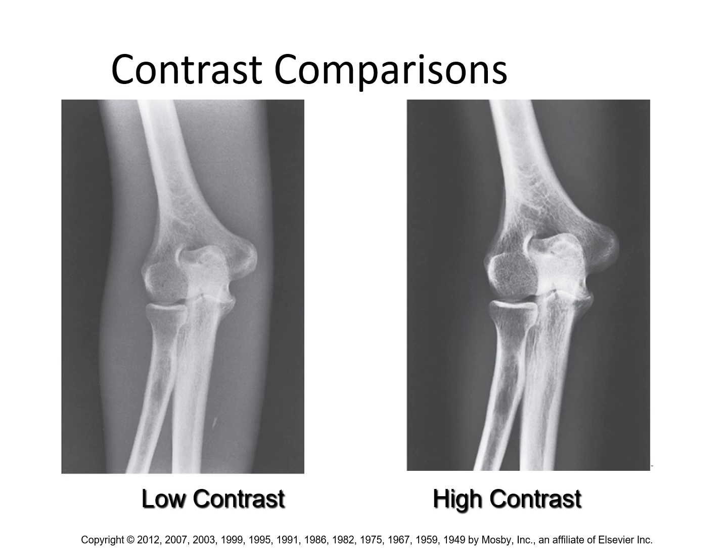In the right-hand picture, I would challenge you to find more than 5 different colors. And so the grayscale, we say the grayscale is truncated or shortened on the right-hand side image. That produces higher contrast. The difference between the dark colors and light colors is greater because there's less available options. You see? Okay. If you don't completely wrap your head around that, just keep listening and you'll get the hang of it.